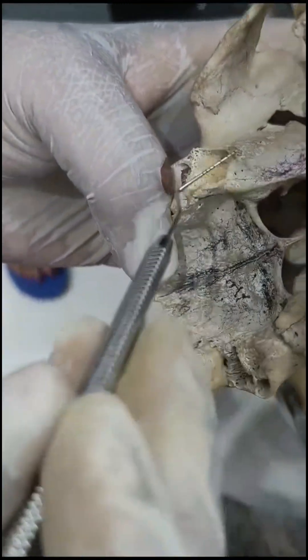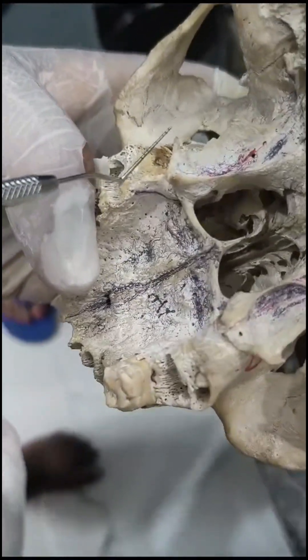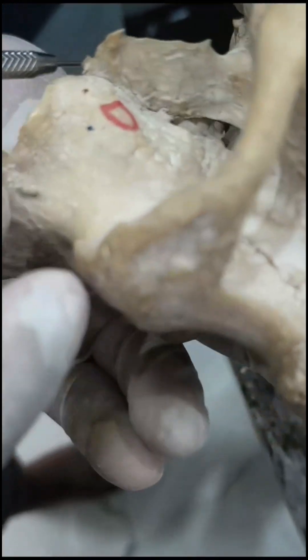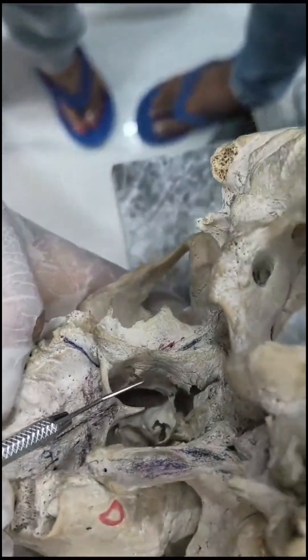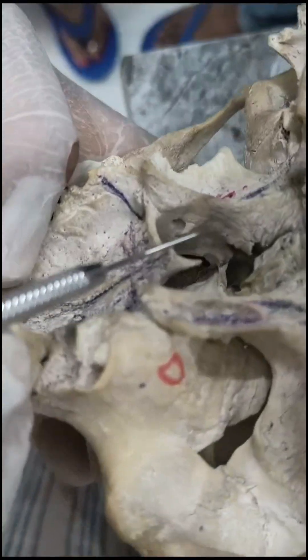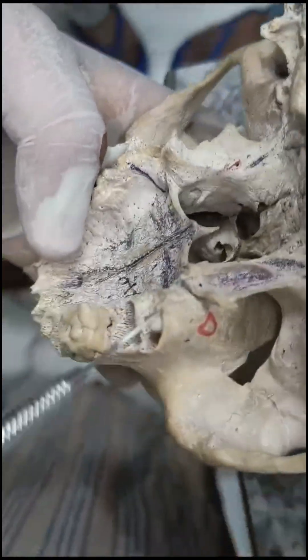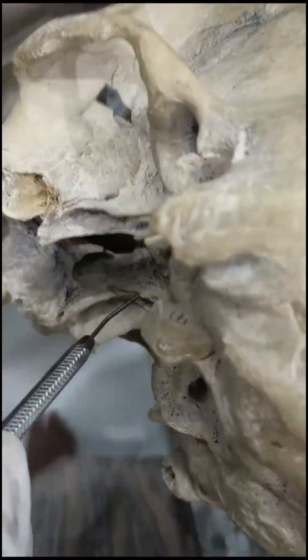The moment we tilt it more — like 30 degrees — we are going towards the dehiscence. This dehiscence is very common: 80 percent prevalence. On this skull that I own, I have found dehiscence on both sides.